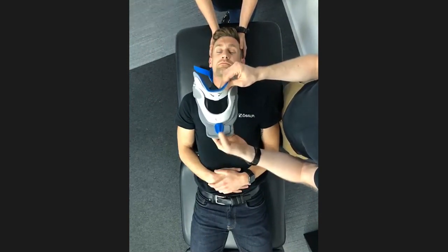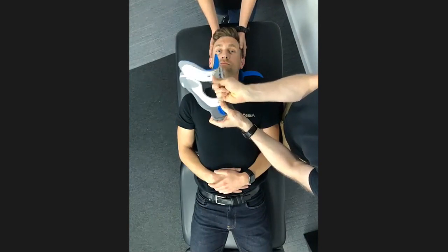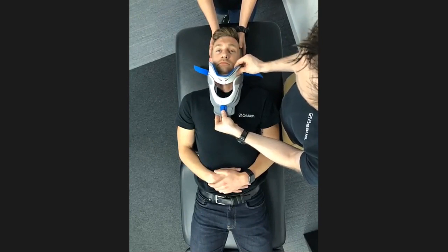So away from the patient initially, we're holding this in the center, adjusting this to the height we need, and we can then offer this up to the patient. So I'm just going to make a touch adjustment there.